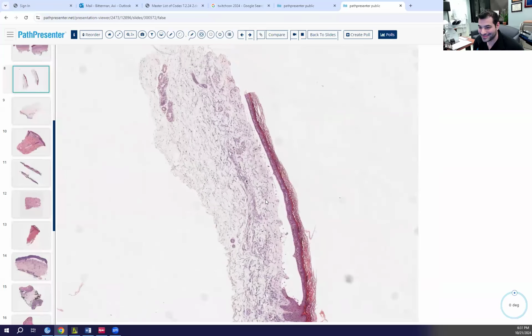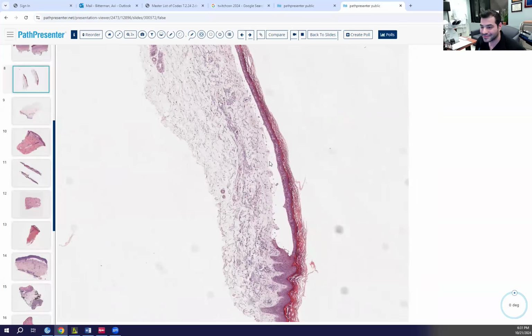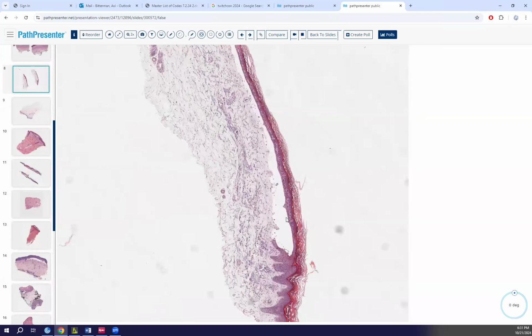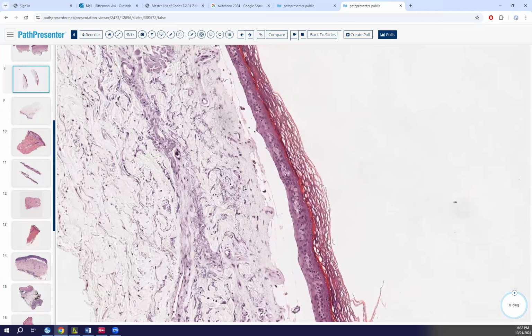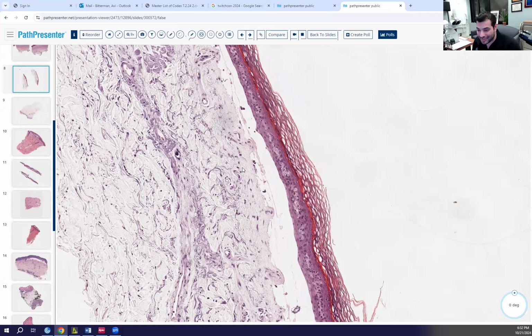And this? Let's see, subepidermal split. There doesn't seem to be necrosis of the epidermis, acute one. I don't know, this kind of looks like PCT again. Yes, it kind of looks like PCT again, but it's not PCT. So what is it? Pseudo PCT? Pseudoporphyria. Very good. Yes, pseudoporphyria.